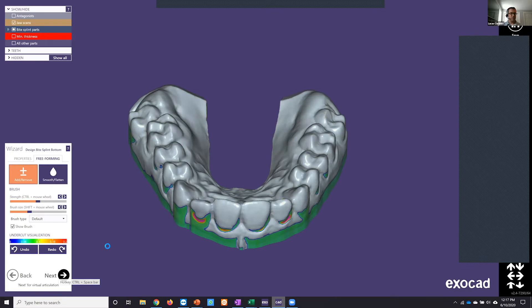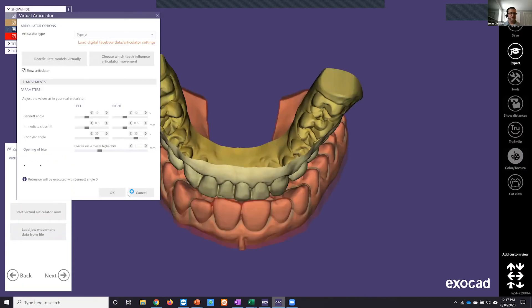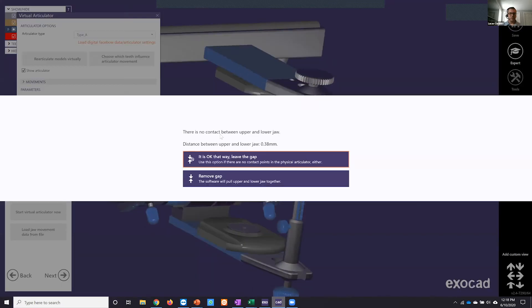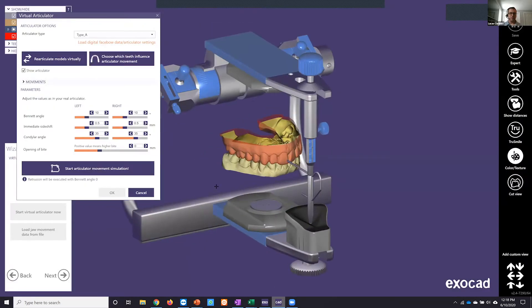The next step in the wizard is the virtual articulator module — optional but really critical and useful for bite splints. Clicking 'start virtual articulator' loads a sub-panel. You can load one of 12 different articulator types. All the adjustments on a physical articulator can also be adjusted in the software. The scans came in already opened, so we'll accept that and see our virtual articulator on screen.